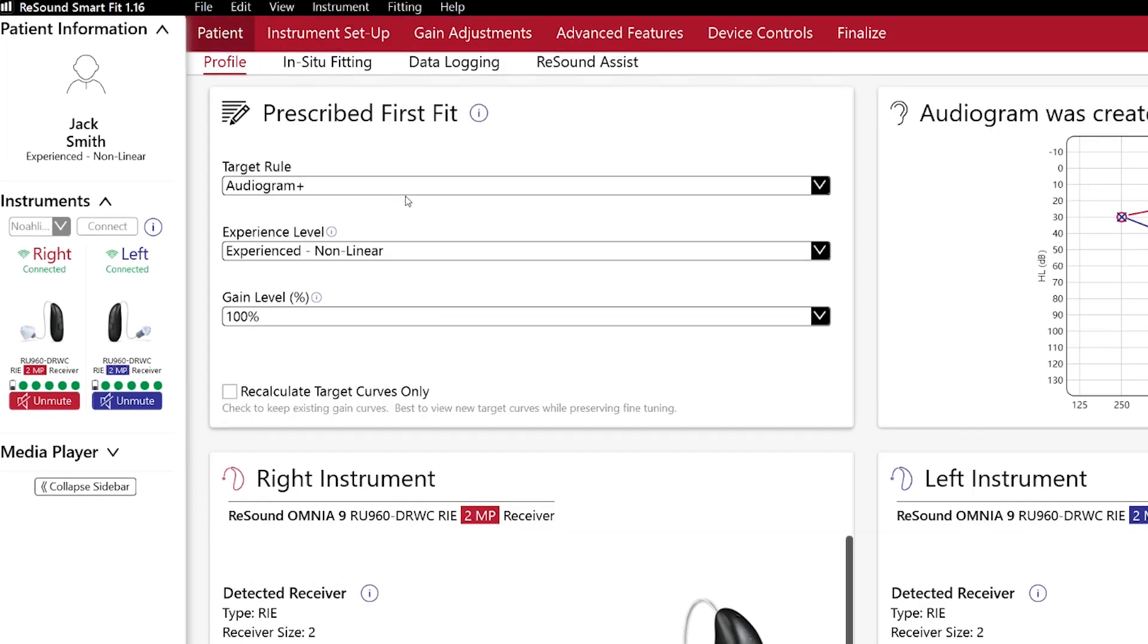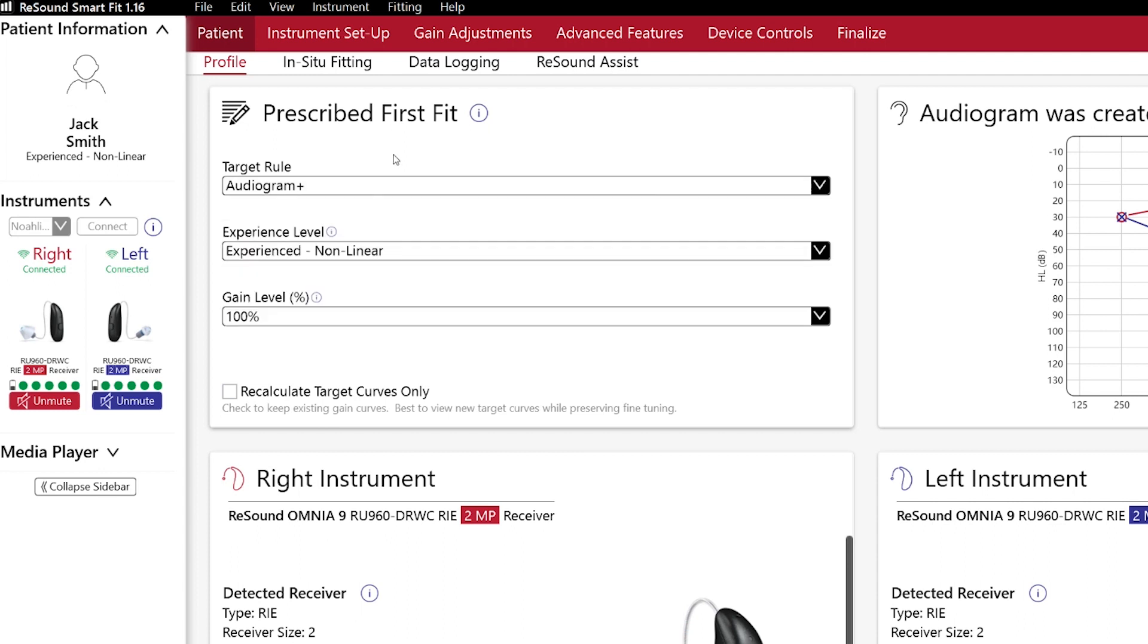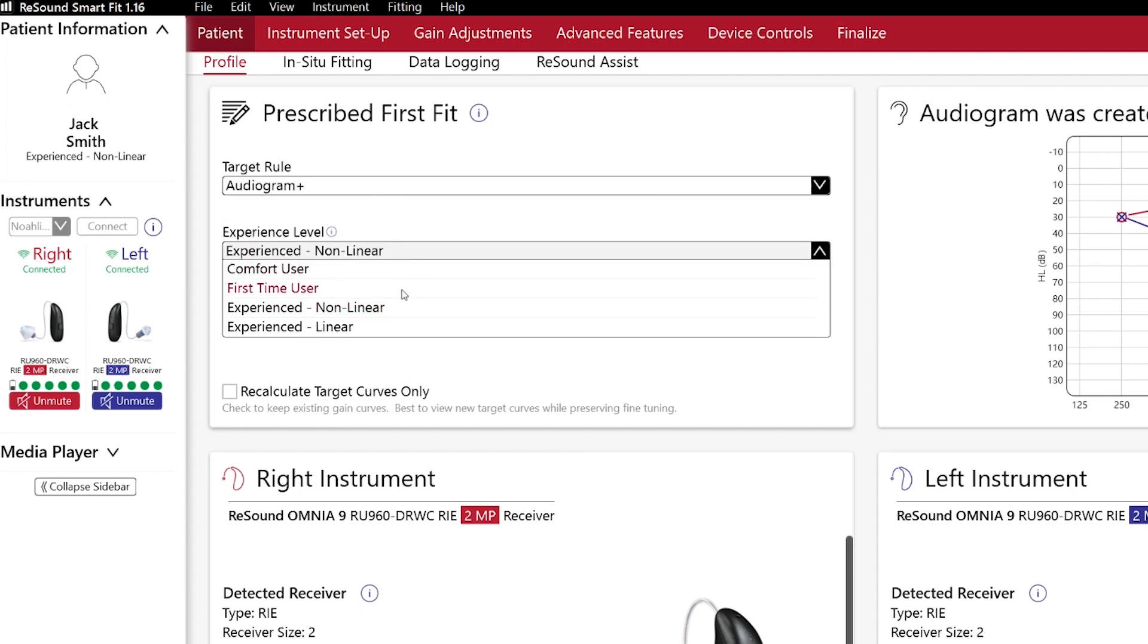Let me go to patient. Here you can select the target rule. Audiogram Plus is the one for ReSound. But if you prefer to work with a different one, you can do it here.